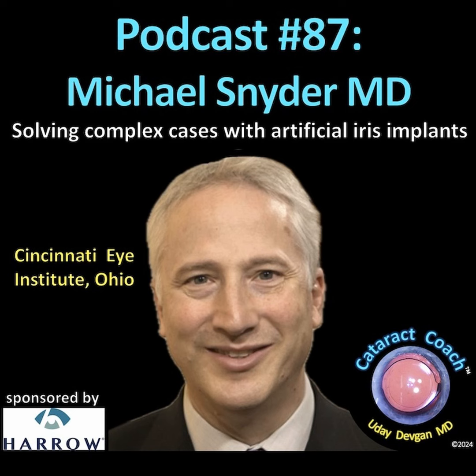Well, they're fun cases, but when you've got a beautiful view of the capsulorhexis margin, you don't think about the fact that when the red reflex disappears, so does that. No, for sure, because that big implant, as it goes in the bag, blocks all your red reflex. And if you didn't stay in the capsule, good luck figuring out where it is. Yeah. So, I still follow that patient. It was 15 years ago exactly.